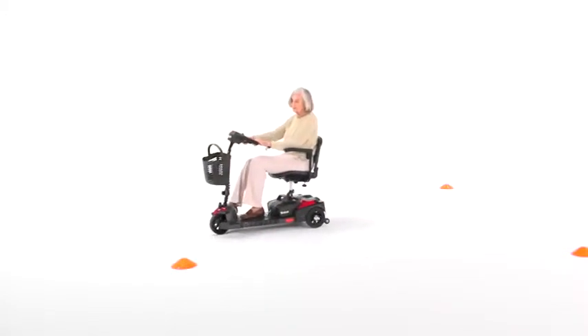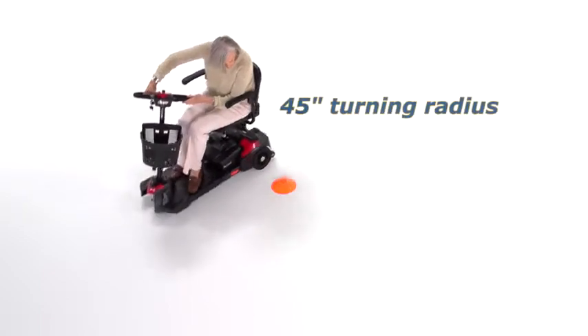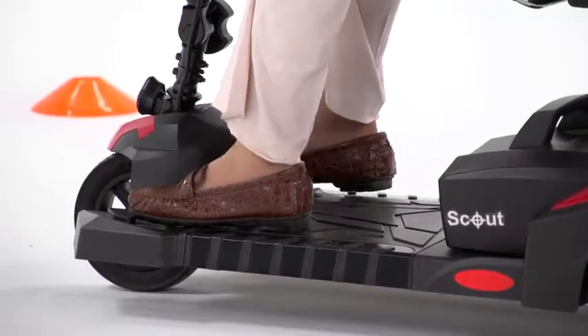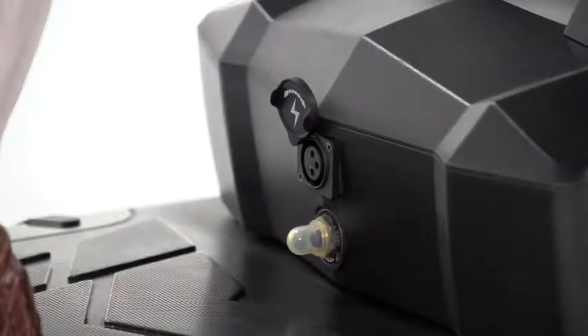With the Spitfire Scout 3-wheel version, you get great maneuverability in tight spaces with an amazing 45-inch turning radius and an extended footboard, which benefits taller riders. And when the battery gauge shows the need for recharging, it's simple from the port on the battery pack.